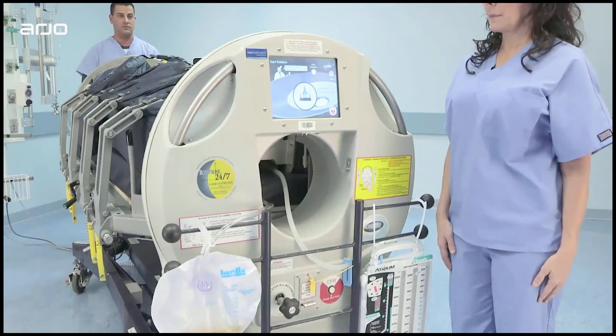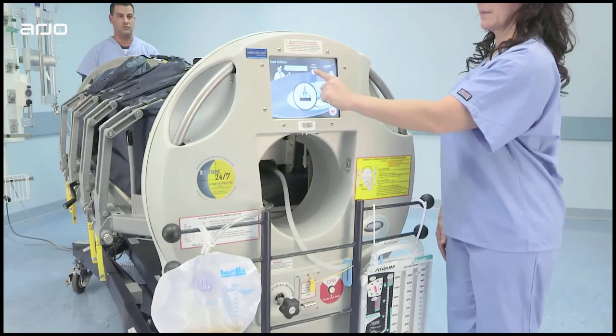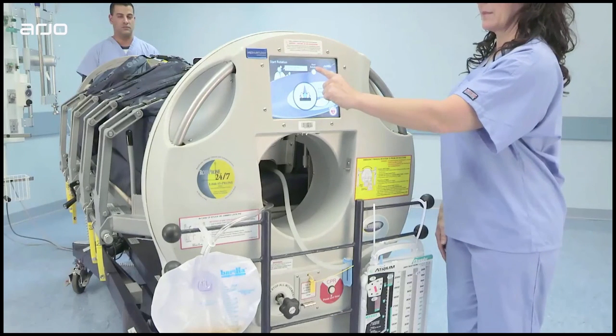Once the entire checklist has been cleared, the Start Rotation screen will appear. Press the Start Rotation button and kinetic therapy will begin in the supine position. To stop rotation immediately at any time, the lock pin can be pushed in.